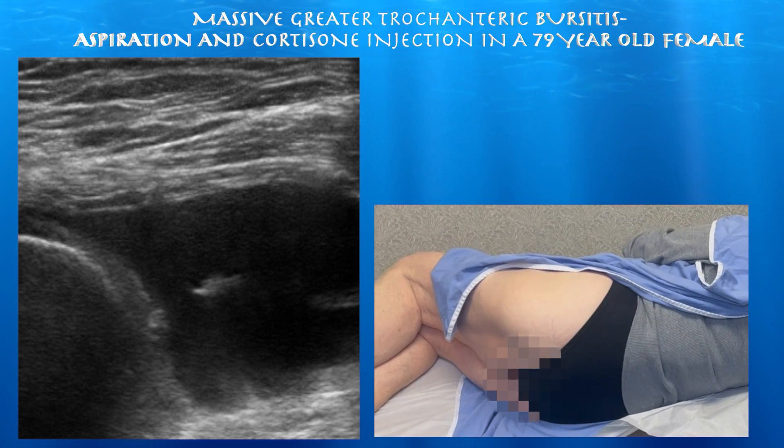So now we have a female with chronic left hip greater trochanteric bursitis. We're going to go ahead and do an ultrasound guided injection of the greater trochanter.